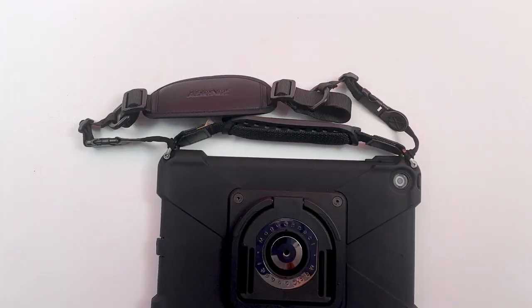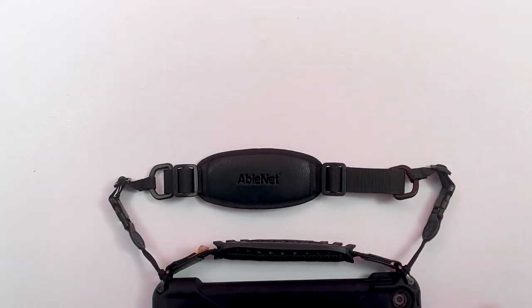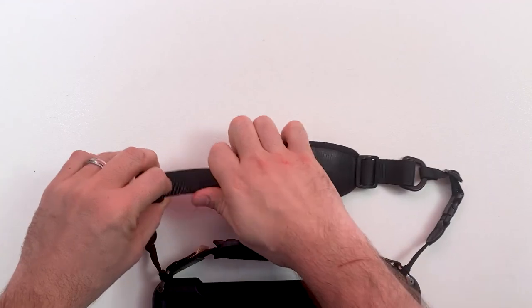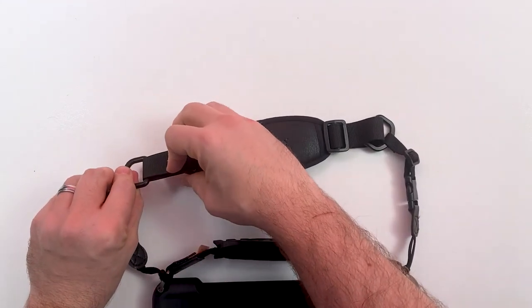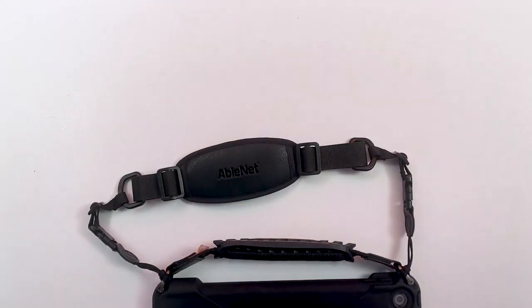Make adjustments to the length of each strap as needed. To adjust the length, you'll slide the two sets of buckles along the nylon strap. Slide the buckles away from the center to extend the length of the strap and towards the center to shorten it. Adjustments are easier to make when the strap is loose.